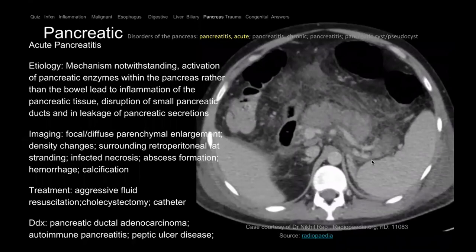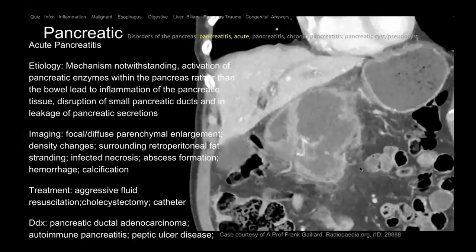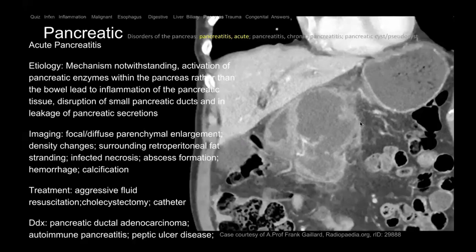Pancreas — on this CT of the abdomen and pelvis, here's the spleen, liver, pancreas, and duodenum. There's all this inflammation around the pancreas — the normal fat intercalated into the pancreas is obliterated with interstitial edema. This is pancreatitis. You can diagnose pancreatitis with lipase and amylase, but we get CT to diagnose complications. One complication is necrotizing pancreatitis — the pancreas is no longer enhancing and there's a fluid collection in place of normal pancreas. Patients with necrotizing pancreatitis have an eightfold increase in mortality — it's very dangerous, with high morbidity.